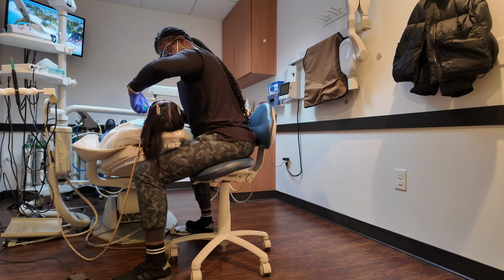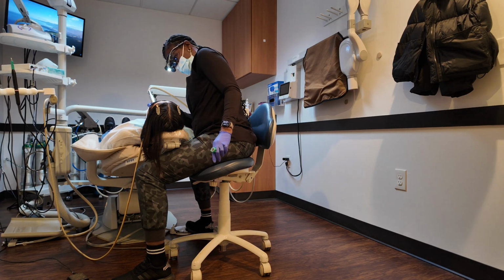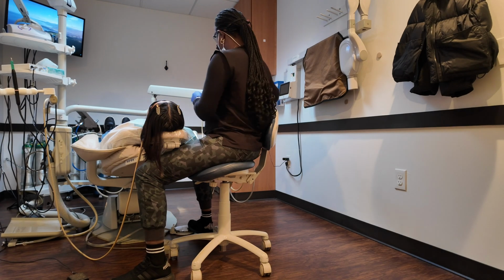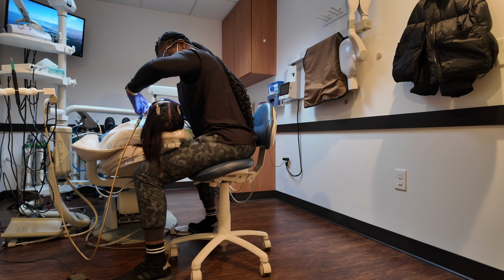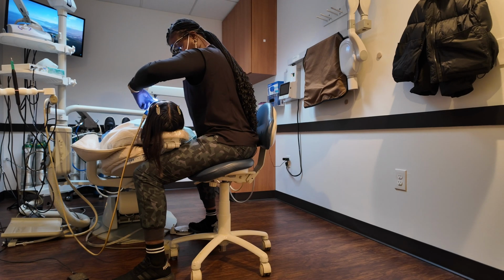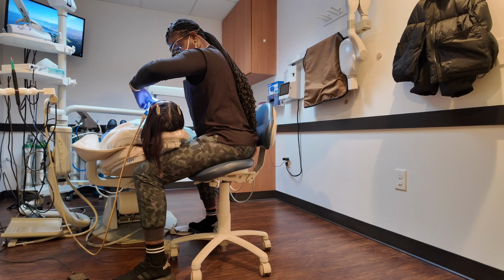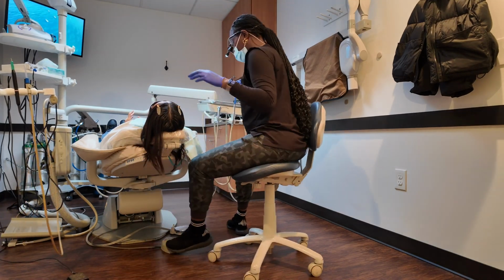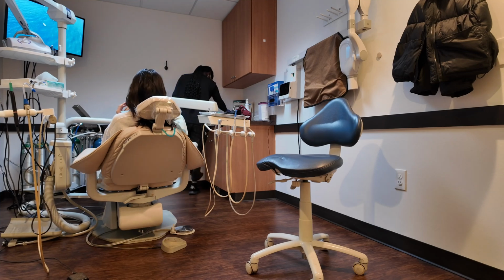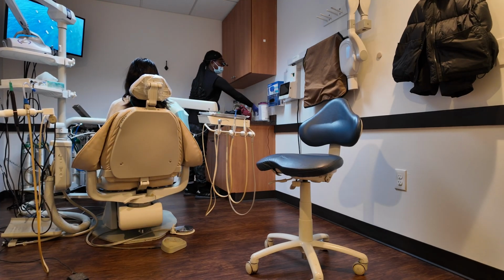So after polishing the teeth, last thing that we'll do is rinse the mouth out really, really well. And so I like to start off by using the air water syringe to spray some water in the mouth because that paste is extremely thick. But then I also like to sit my patients up and offer them a cup with water. That way they can take their time and rinse and swish themselves. It really just depends on what we have going on.